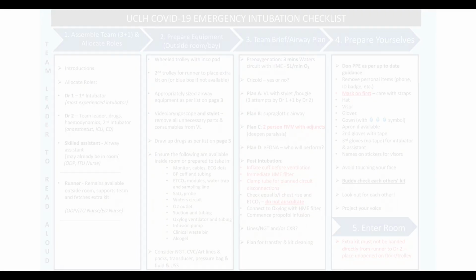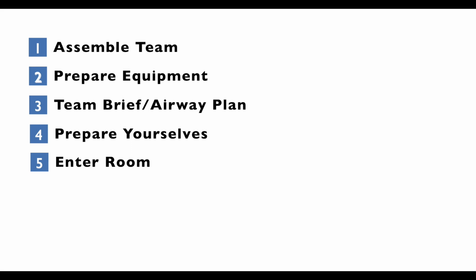Outside the room, these include assemble team, prepare equipment, team brief and airway plan, prepare yourselves, prepare to enter the room. After entry to the room, the steps are pre-intubation checklist and post-intubation.